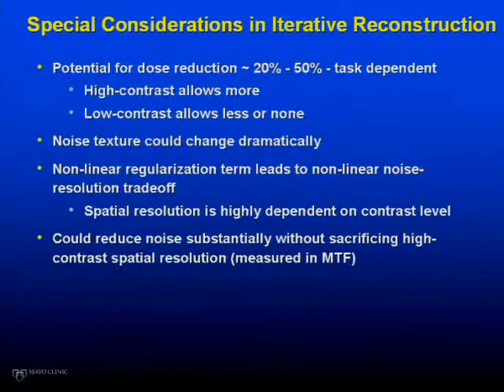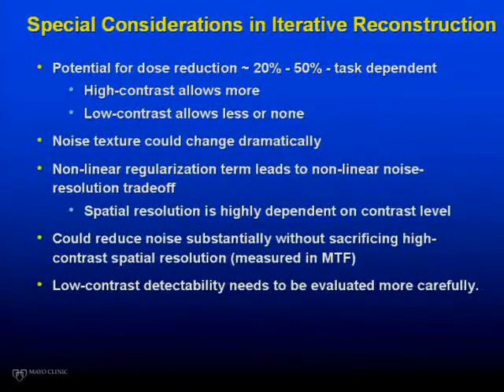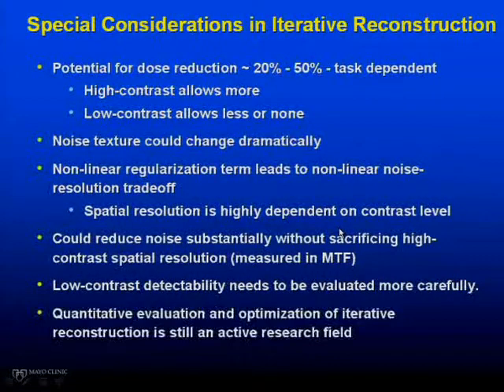This cannot be used to say I can reduce the dose by a certain percent. The low contrast detectability should be the one used to calculate the dose reduction potential, and this needs to be evaluated more carefully. The quantitative evaluation and optimization of iterative reconstruction is still an active research field.